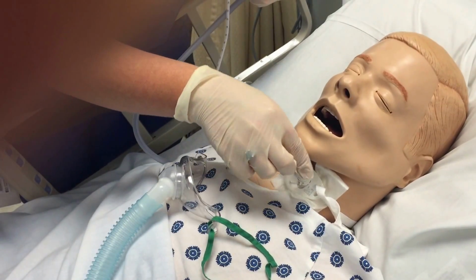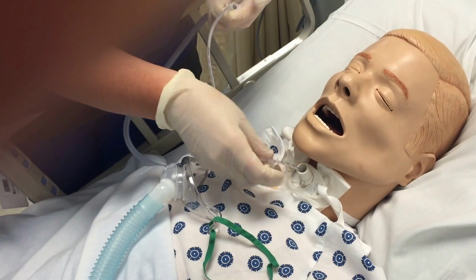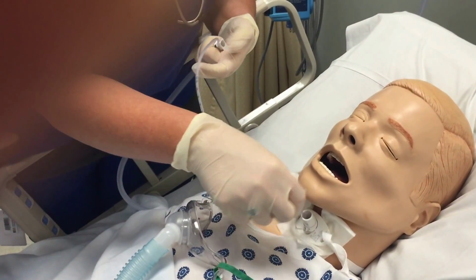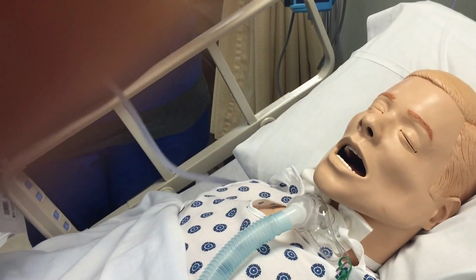One more time. And being sure not to let that touch the inside there. And we'll cough, okay? And then suction on the way out, intermittent. Okay, there you go. Good job. Okay, and you can go up to 2 or 3 times.